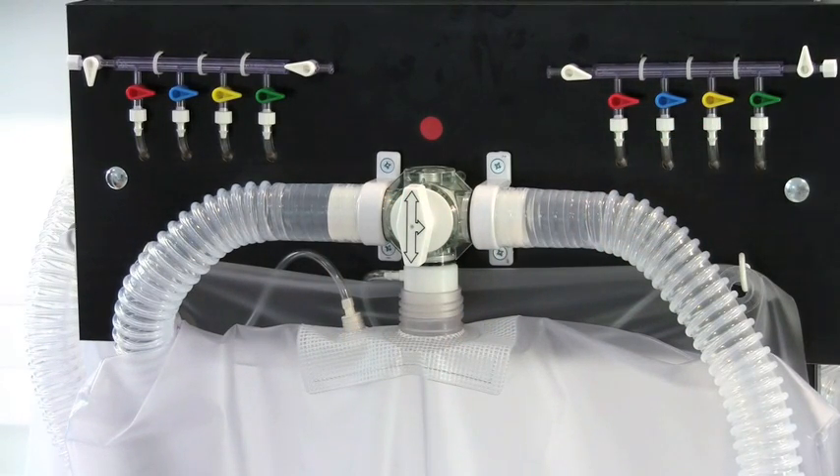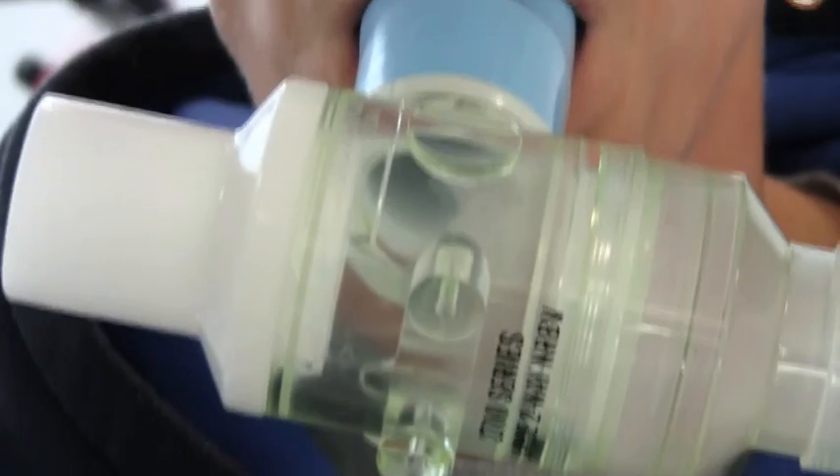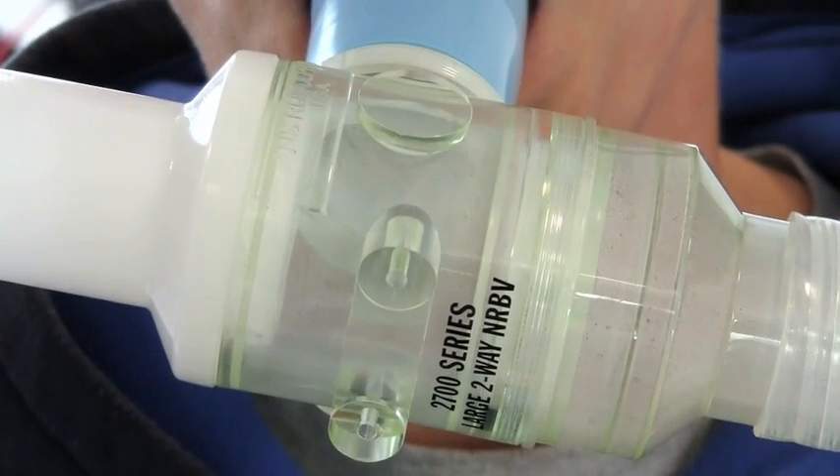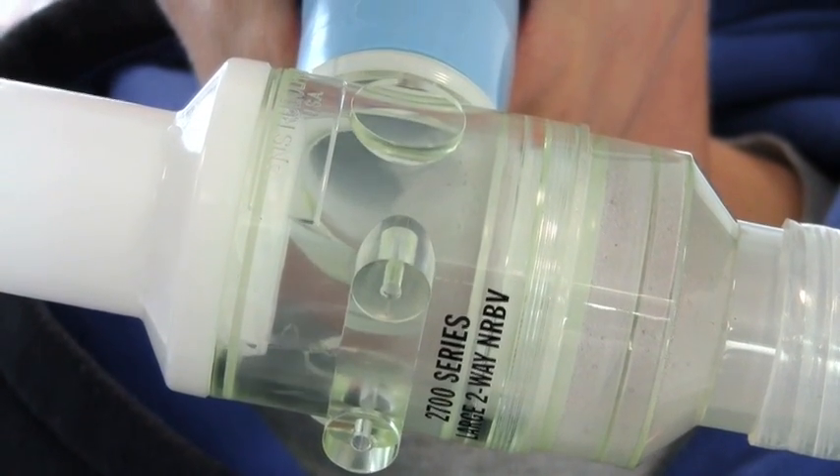We normally do this for a minimum of one minute and a maximum of around five minutes. The two-way valve allows air to flow in from the left into the person's lungs, and when they breathe out it goes to the right and it gets steamed up because the air is humidified with water vapour.